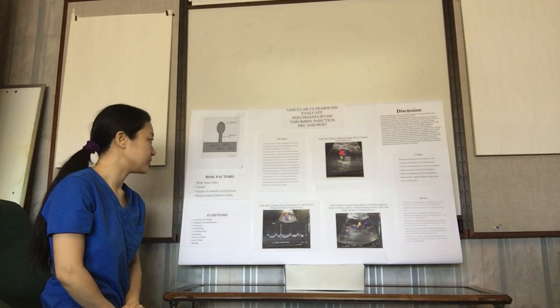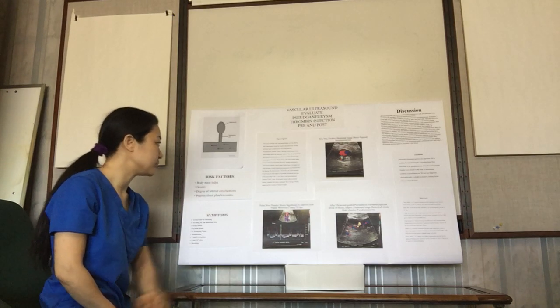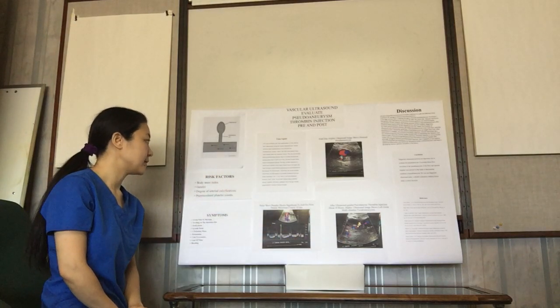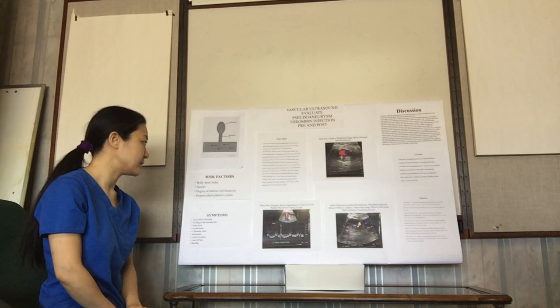The next day, the vascular tech did a limited vascular lower extremity arterial duplex exam on her again, and noticed that there is a multi-chamber pseudoaneurysm, mostly thrombosed, in her left groin. The first measures 1.5 centimeters times 0.8 centimeters. The second measures 0.9 centimeters times 0.9 centimeters. The third appears to be partially thrombosed with an open portion measuring 1.3 centimeters times 1.7 centimeters.